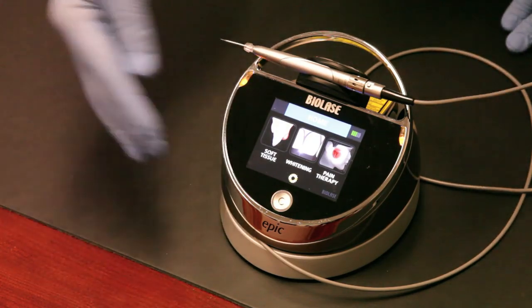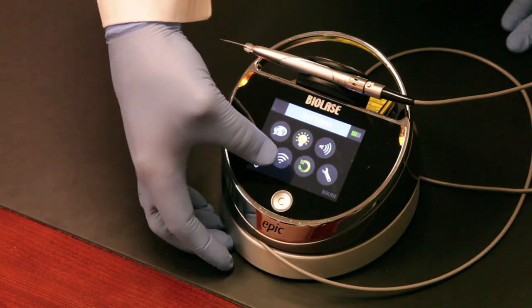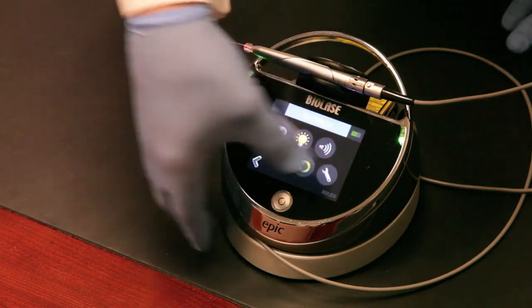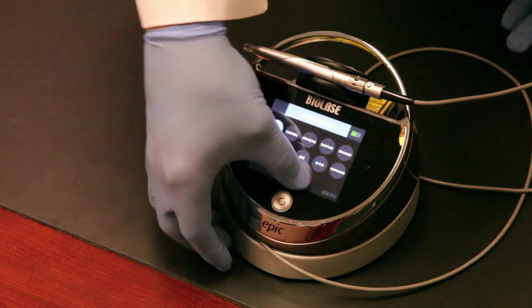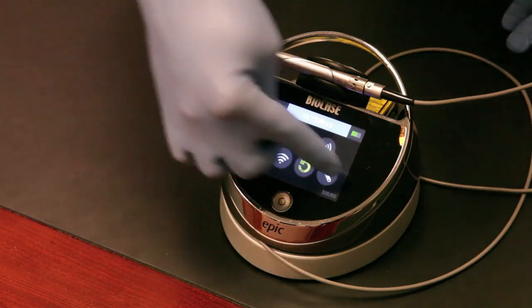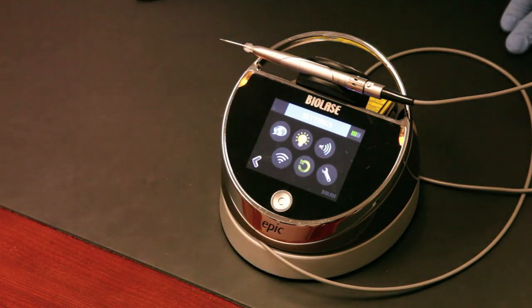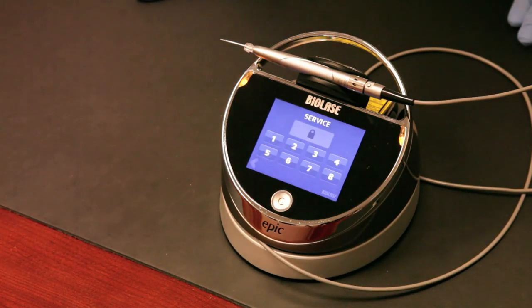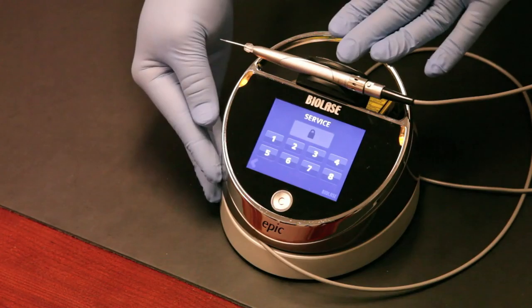If you run into issues or need troubleshooting, you can go to the setup screen. There you can adjust the aiming beam brightness, the language — there are multiple preloaded languages — and the volume of the unit. There are also settings for the wireless Bluetooth foot pedal, and a screen for service technicians if they need to perform laser service on your EPIC. That's the user interface overview.